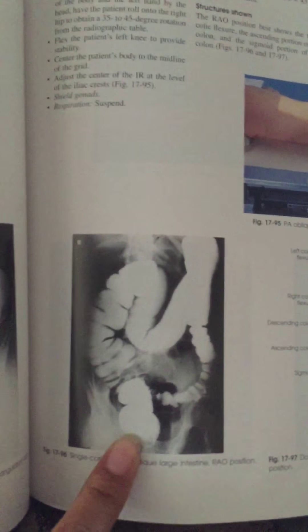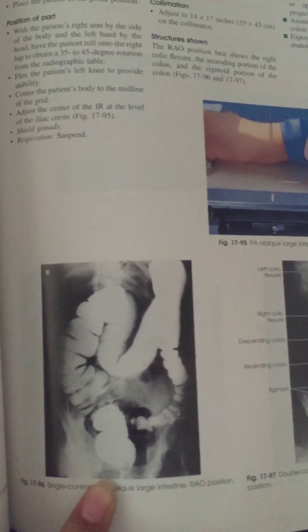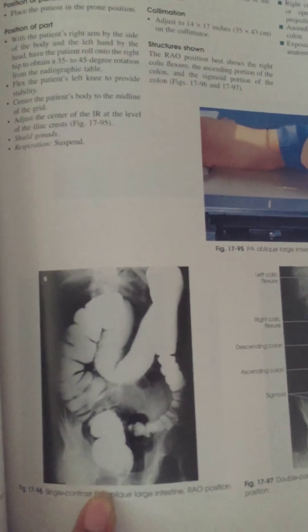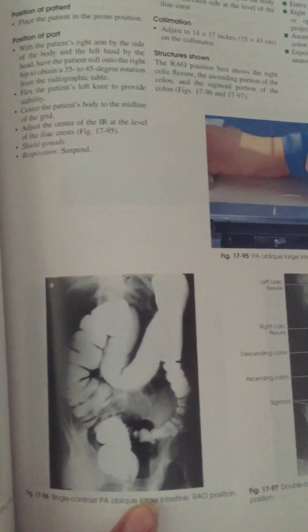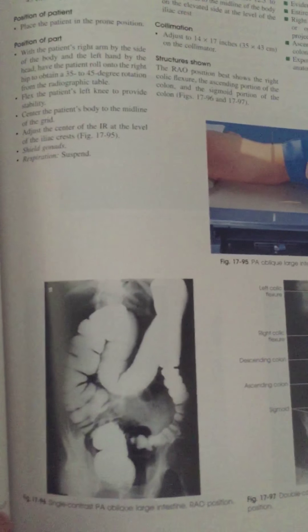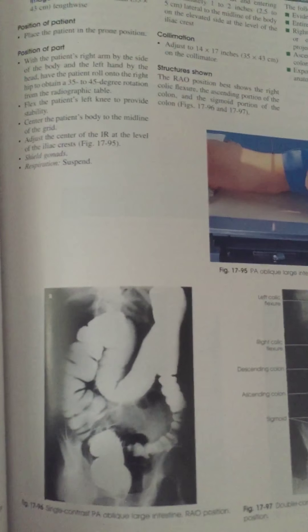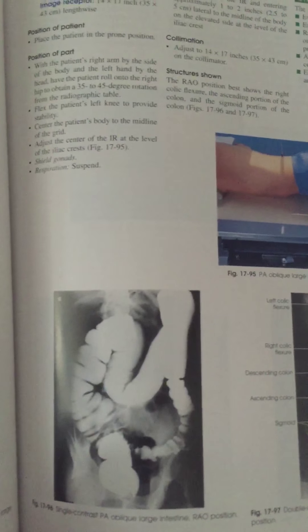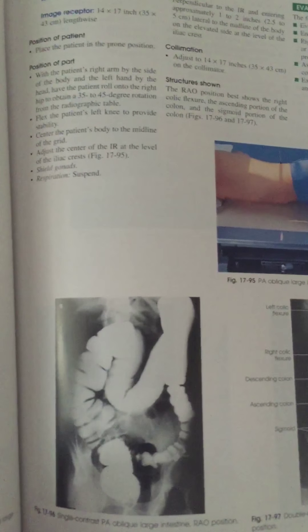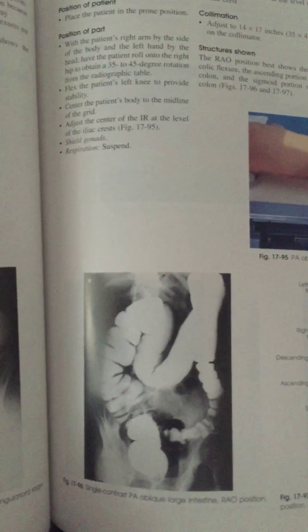This is what the RAO image looks like. To confirm a proper image, you want evidence of proper collimation, the entire colon inside, and the right colic flexure less superimposed or open compared with the PA projection. The ascending colon, the cecum, and the sigmoid colon should be visible, along with an exposure technique that shows all of this anatomy.